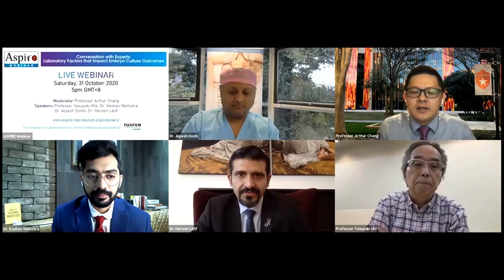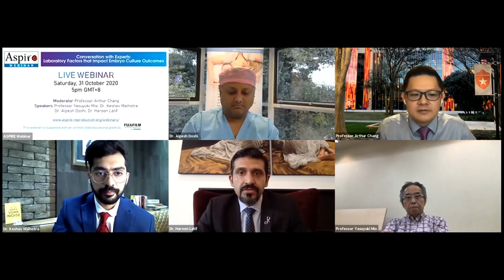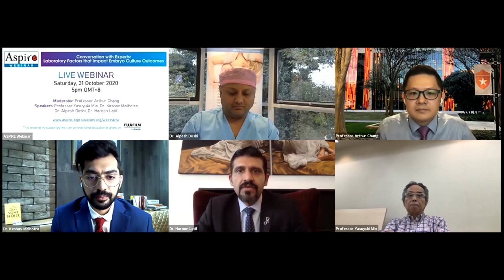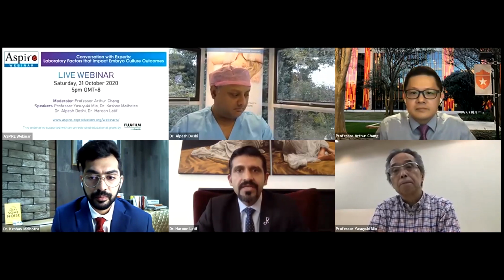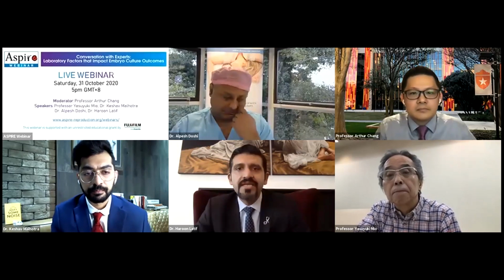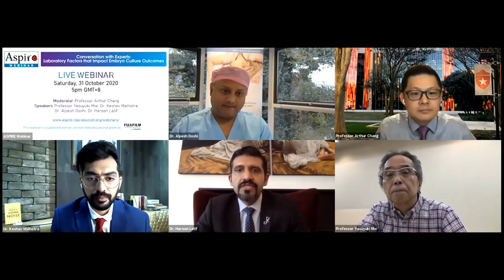From the manager's perspective, would you suggest running KPIs on individual embryologists, or do you think that's too much, too detailed? So absolutely, I think work in the IVF lab is heavily operator dependent, and obviously you have to run KPIs with your new embryologist coming in, as well as your senior embryologist. So one should always have that data in the lab. You should look at it depending on what indicator you are looking at. You can do it weekly, monthly, or even quarterly, depending on the indicator. And each embryologist's work has to be documented. And then if someone is lagging, the fertilization rates are different from the other colleagues, we can look at the skill set and go back.